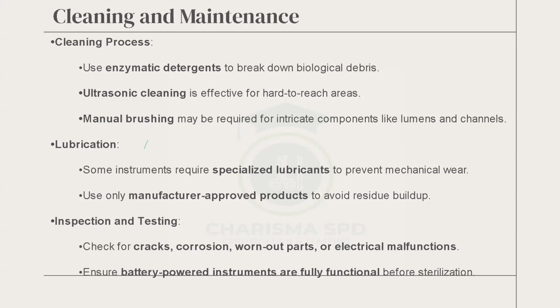Use only manufacturer-approved products to avoid residual buildup. For detergent selection, it will always tell you neutral pH. Then it will give you what the lubricant is. For example, in my department, I have Linvatec, Stryker, Ride Medical, Trudy, and Osada.